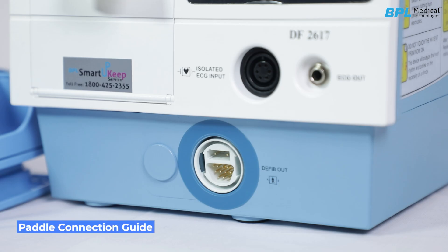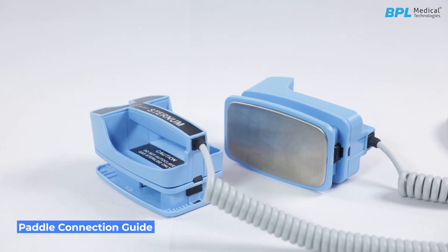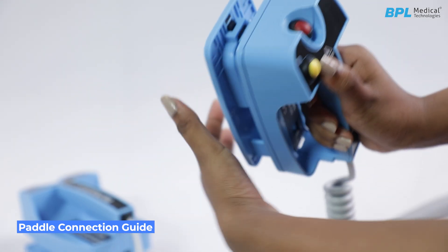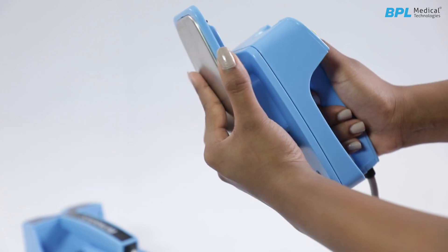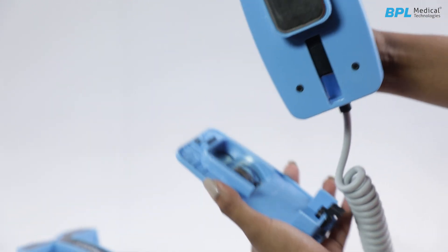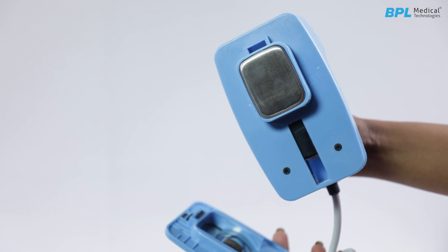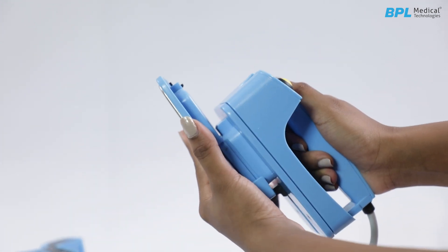Paddle connection guide — switching to pediatric paddles: To use the pediatric paddle on the standard external paddle, slide the adult paddle forward after pressing the latch on the top. Once the adult paddle extends fully, it reveals the pediatric surface. Remember to return the adult paddle after use.